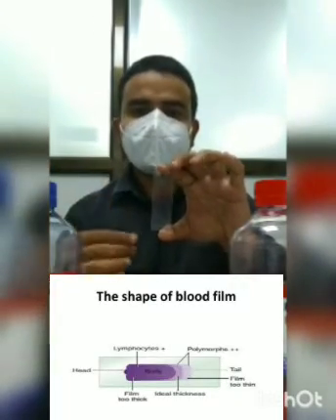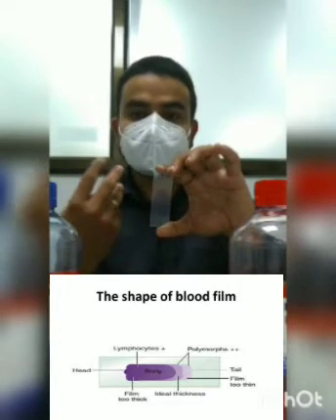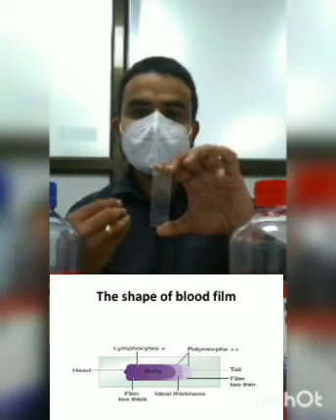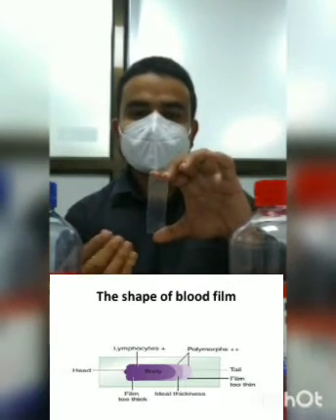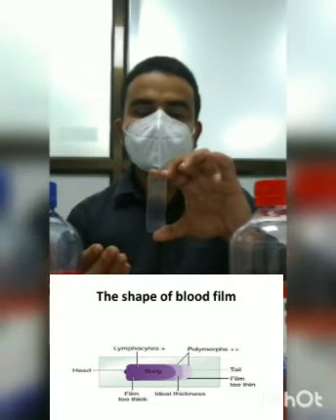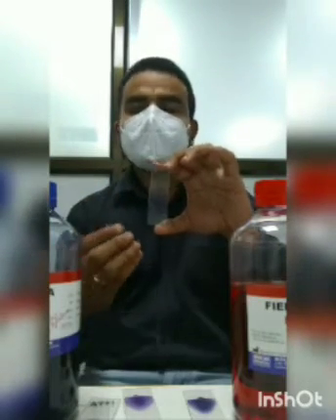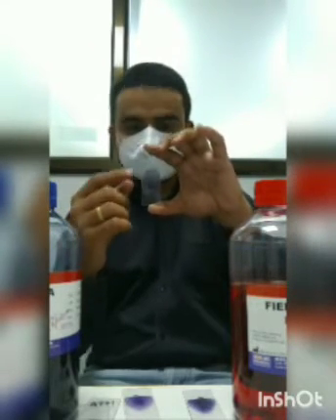We can comment upon whether there is any parasite. We can search for any parasite and its morphological forms. For example, whether it is a gamete of Plasmodium vivax or of Plasmodium falciparum, whether it is a ring form or a trophozoid form. All these kinds of observations can be made.